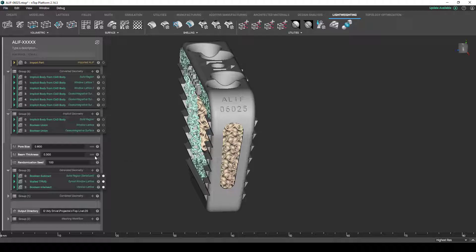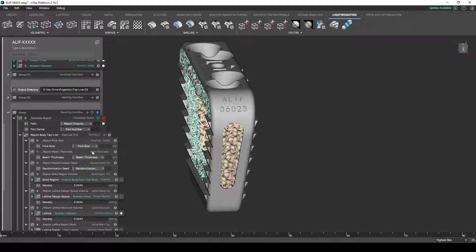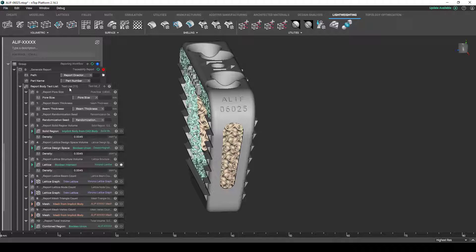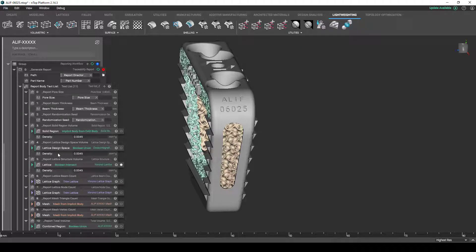The other sub-workflow that we see in this example is actually this set of reporting blocks. If we want to learn more about how this reporting workflow works, feel free to refer to my previous nTop Live about generating reports. But the gist of it is that the workflow that we have created is a repeatable process, but each input that we plan on pushing through is going to yield a unique set of results.